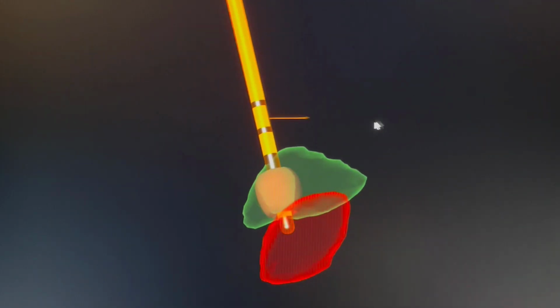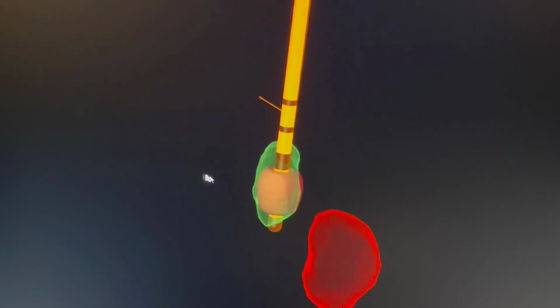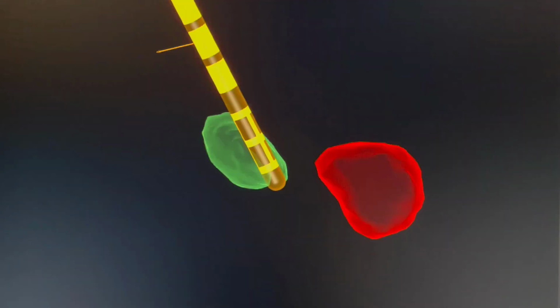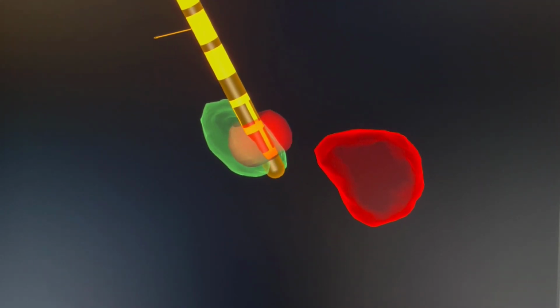Here we have a rather well-placed electrode, and we mostly need to decide on which level to focus. When the electrode is slightly off the intended target, as in this case, then it seems natural that we would like to move the field of stimulation towards the intended target, as seen here.